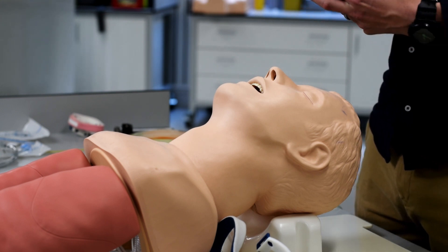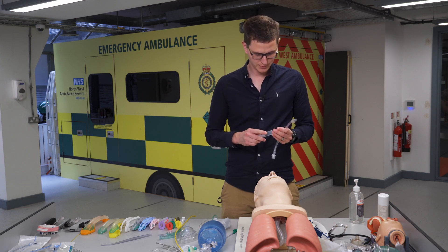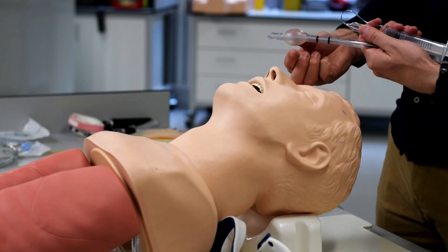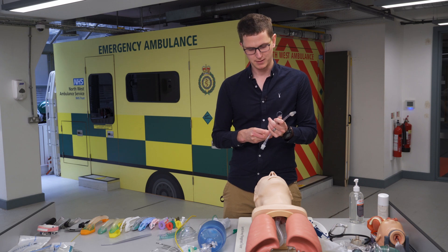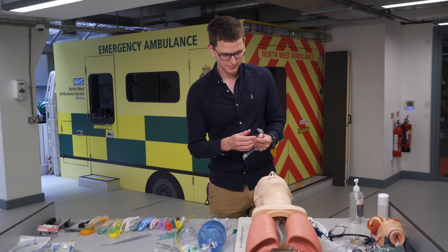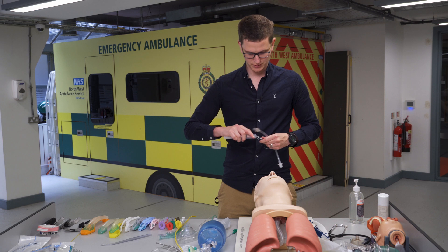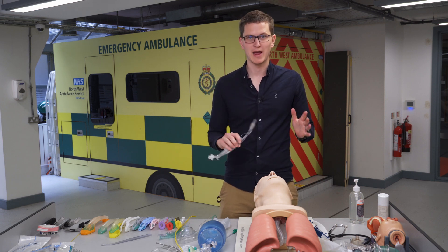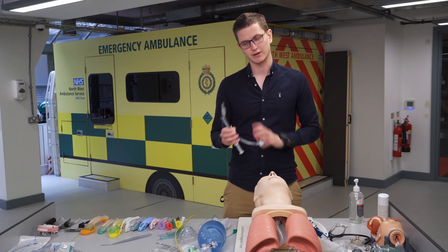Let's go through the equipment needed for intubation. You need a cuffed endotracheal tube and a small syringe attached to that cuff — without the syringe you can't inflate it. The number one rule of intubation is being prepared. Place the tube and syringe on your right-hand side because that is your working hand.